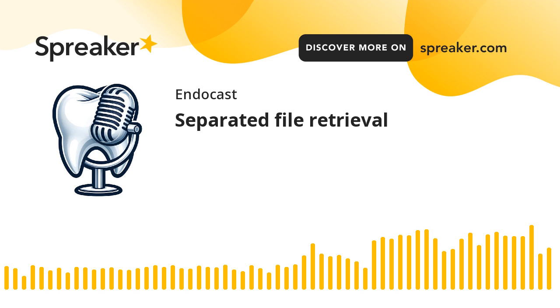If I can see the file, then there is an option to do retrieval based on skills and experience of the operator. So if I'm familiar with the tools, the patient already knows about the procedure and also the cost for this kind of treatment. The location of the file also is a factor.